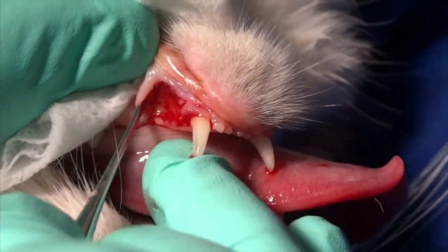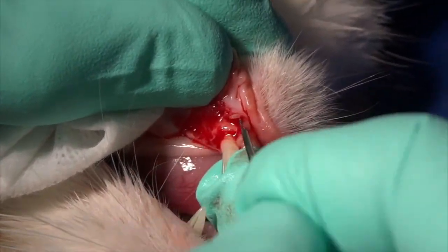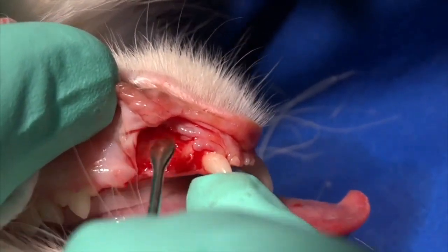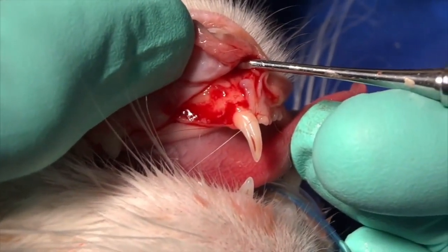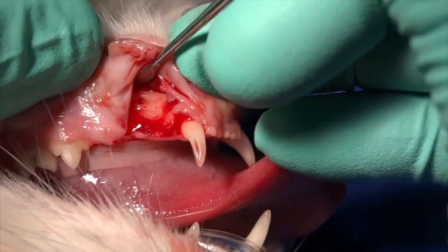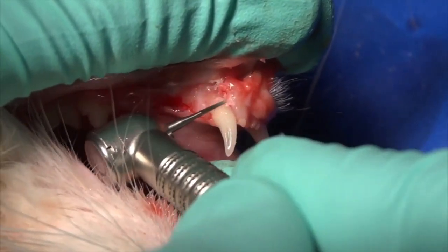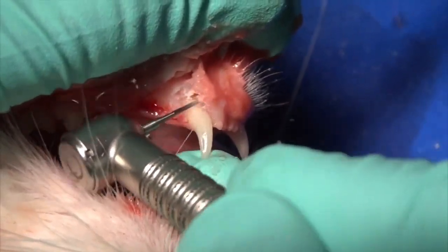We can take care of that at the end when we're through. Right now we're working to get more exposure, working distal and then toward the mesial part of the attachment to release that tissue. We can turn the periosteal elevator over once we've got reasonable exposure and use the larger end — this is an EX9 feline periosteal elevator from CISLAC. We're using that large portion to expose the majority of the bone after fine tuning. Once we pull that tissue back, you can see the middle mental foramen just beneath that elevator. The bone is fimbriated at the edge — it's not normal, it's a little expanded. Now we'll use our cross-cut tapered fissure burr, our 701L burr, to remove the vestibular bone.